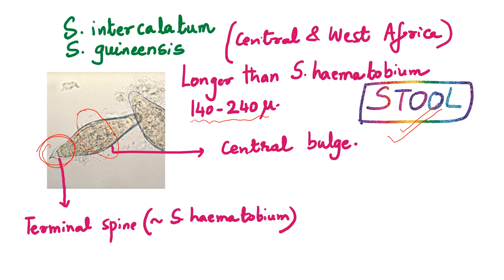Let's quickly review the eggs of schistosomes. Eggs in urine with terminal spine: Schistosoma haematobium. Eggs in stool with terminal spine: intercalatum and guineensis. Stool eggs that are rounded with small lateral spines: japonicum or mekongi. This finishes our eggs of all the flukes.